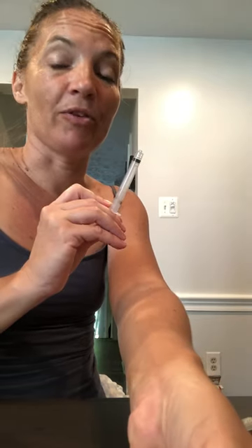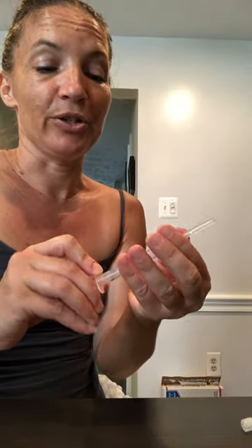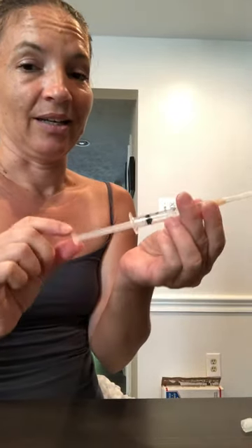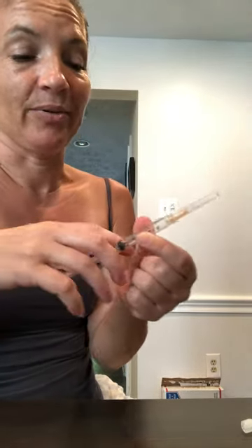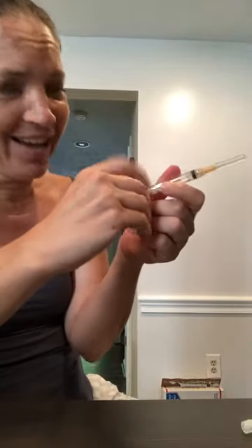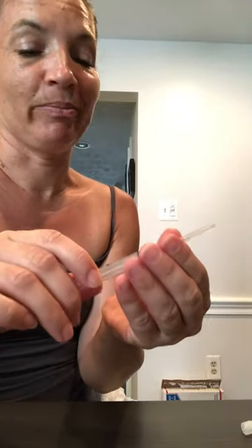So I decided just now to take from the good set that needle and put it on to the plunger of the problem set, and there you go. No matter how hard I try, I can't get that thing to shoot across the room. So it is most definitely a problem in the needle tip.